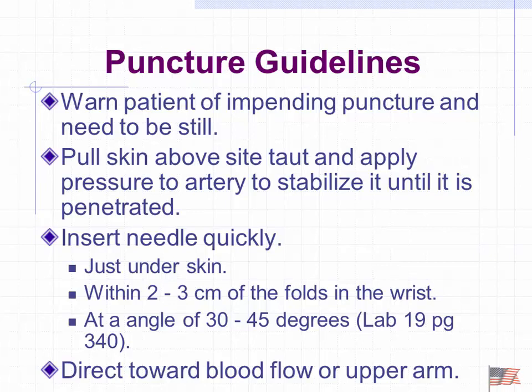And when we pull the skin taut, you should be able to stabilize the artery. Insert the needle just under the skin. You don't need to go very, very deep. It's pretty superficial. We're going to go at an angle of 30 to 45 degrees.